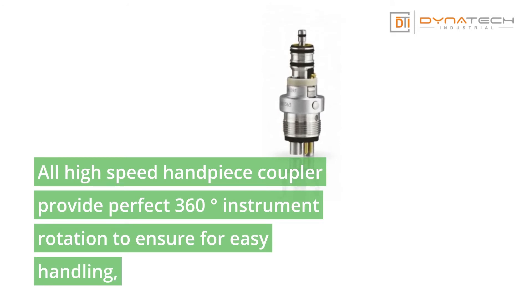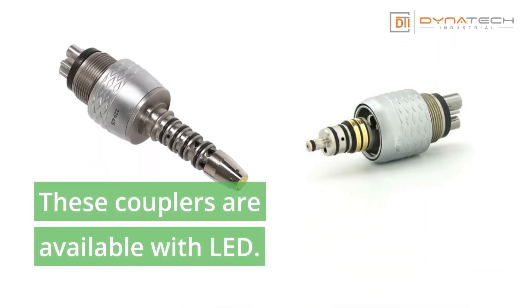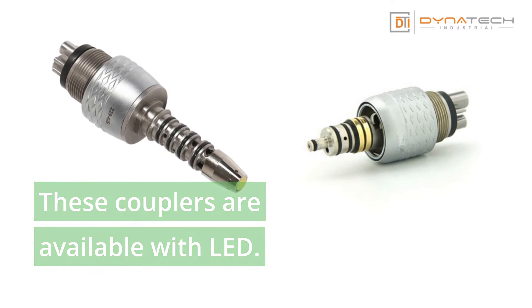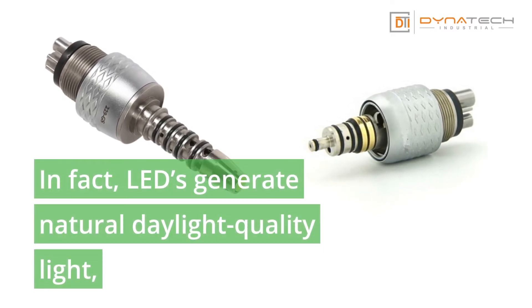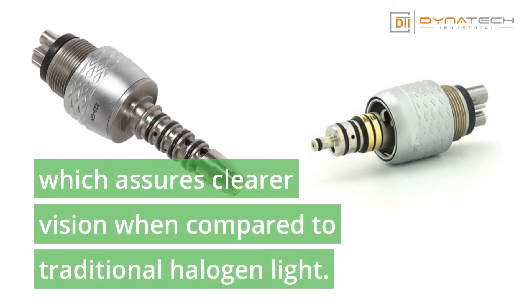All high-speed handpiece couplers provide perfect 360-degree instrument rotation to ensure easy handling and prevent the tube from twisting. These couplers are available with LED. LEDs generate natural daylight quality light, which assures clear visibility when compared to traditional halogen light.